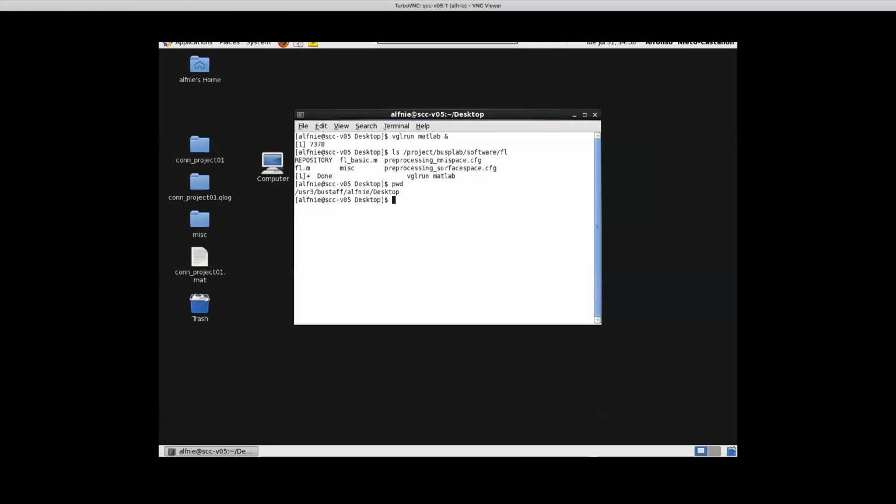And it's actually a triangular tessellation, right? So you have a surface and you represent the surface in terms of individual nodes, and the nodes form triangles, so that you have a triangular tessellation that represents that surface, and it's a very dense one. And then you have that representation of the surface, and you inflate it into a sphere. You continue inflating that until you have a sphere. And now you look at the tessellation of those triangles, how those look in the sphere, and you realize that they are not uniform, right?